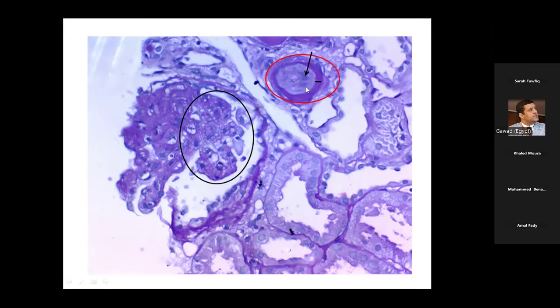We will talk in detail later on, but I would like to say that not every occlusion is a proliferation of nuclei. It could be just an injured cytoplasm. Okay.